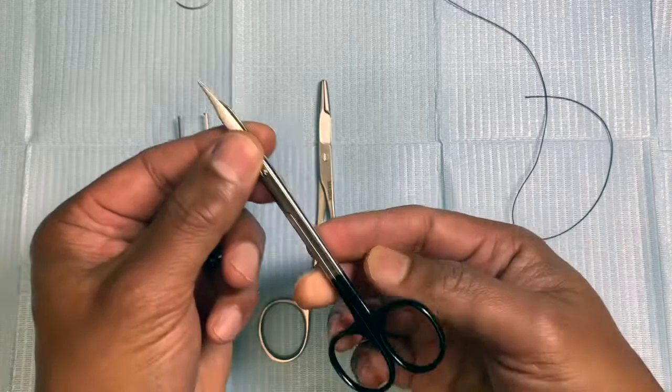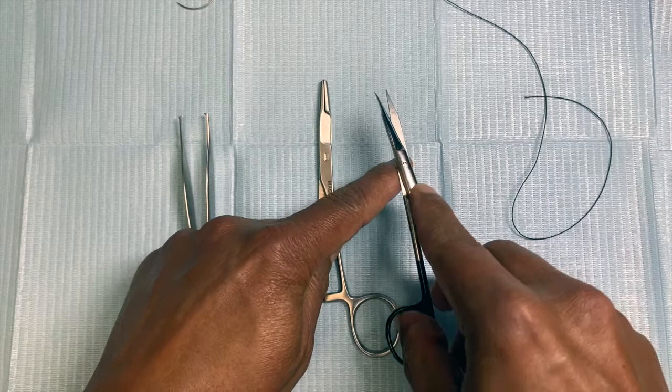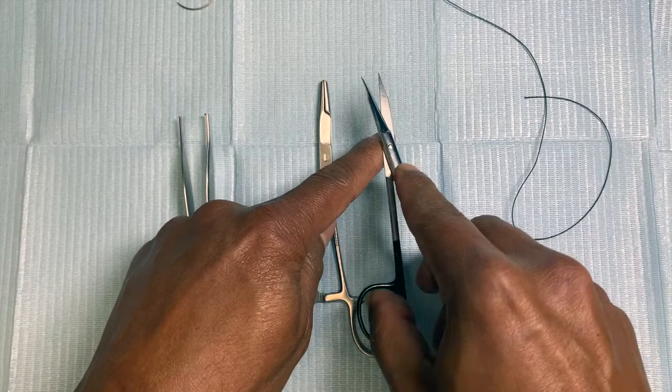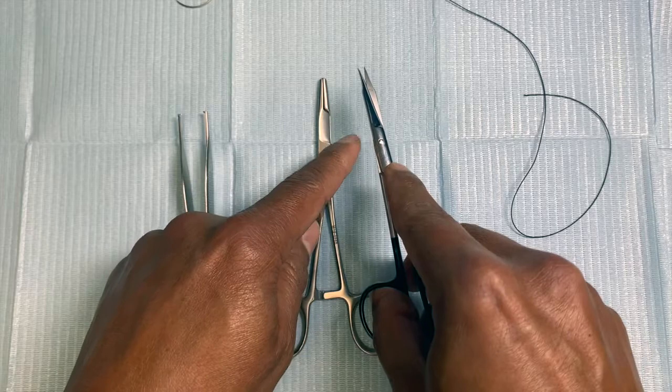For the scissors, you again need to pass it through your ring finger and your thumb, and you can cut using some support from your opposite hand. Come close to the suture and then cut. This gives you full control of the suture being cut — either just above the knot if you want to bury it, or slightly higher up. You can then go to the field and avoid your hands from moving too much.